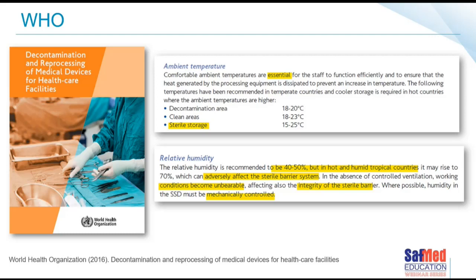A point to consider: what is the temperature in your sterile storage area? Do you measure it? Is there some form of mechanical device that you can go to read it? How do you know what the temperature actually is in your sterile storage area, or the humidity is?